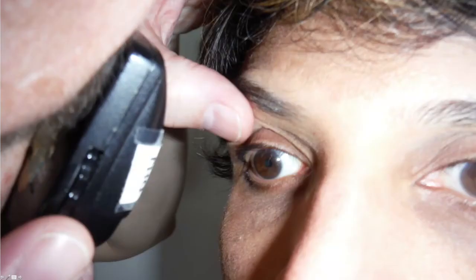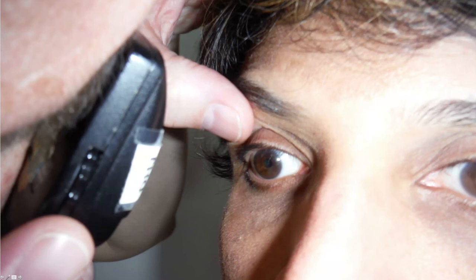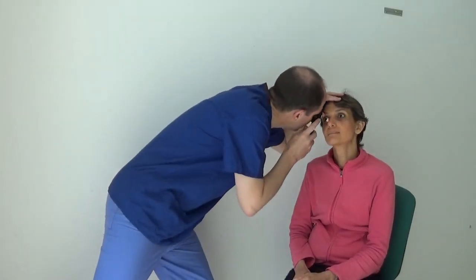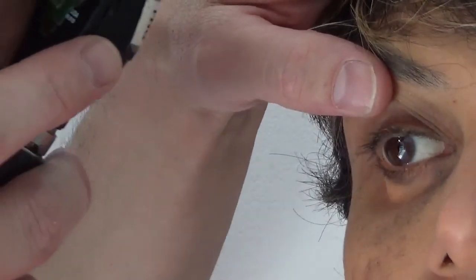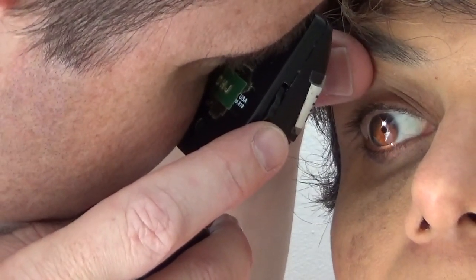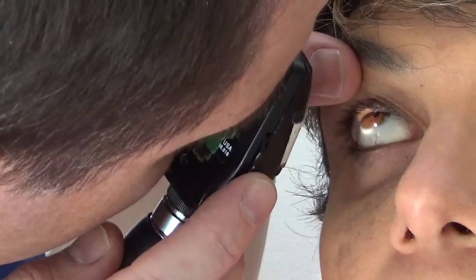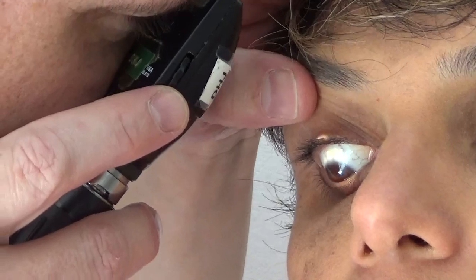My suggestion is that you hold your ophthalmoscope and your nose hard up against your thumb knuckle so that you're as close as possible to the patient. Here is that movement in action — coming as close to the patient as possible by touching the knuckle of your left thumb with your nose and ophthalmoscope. Once you're looking at the optic nerve, get the patient to look up to see the superior retina, down to visualize the inferior retina, left to see the nasal retina, and right to see the temporal retina.